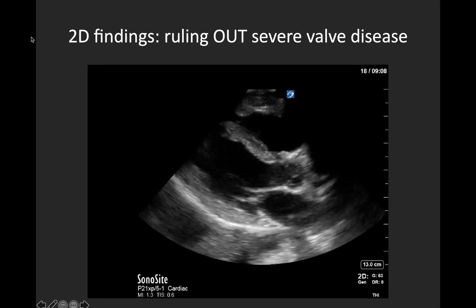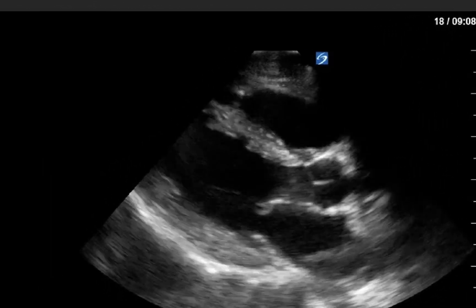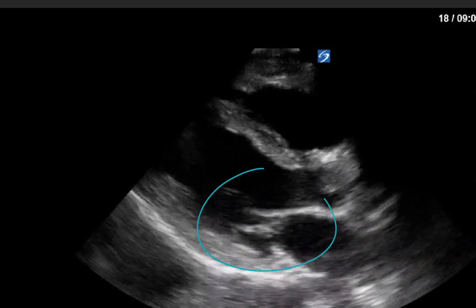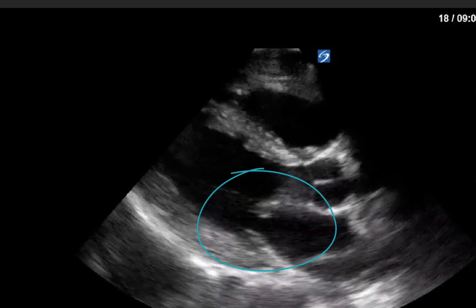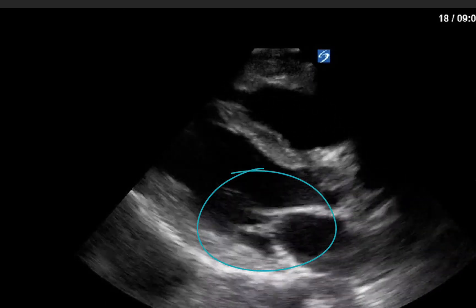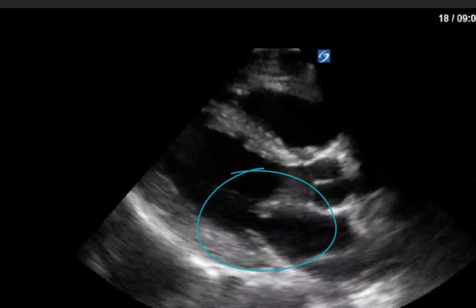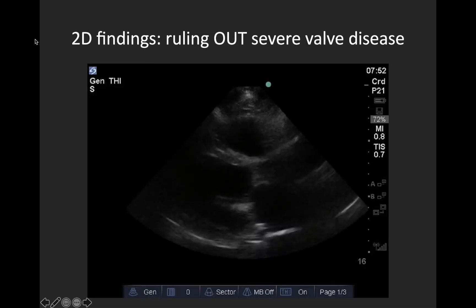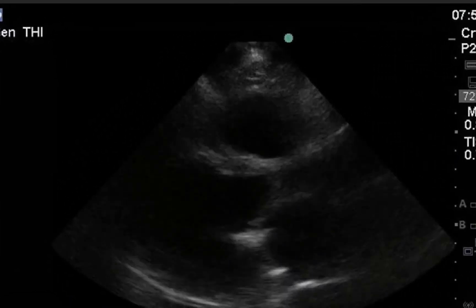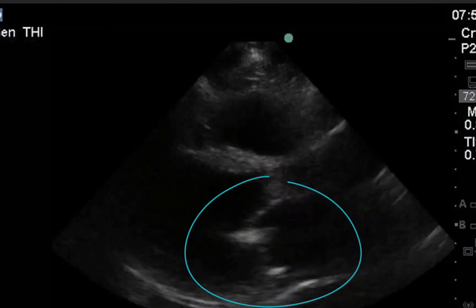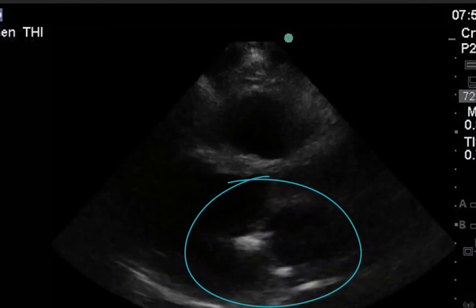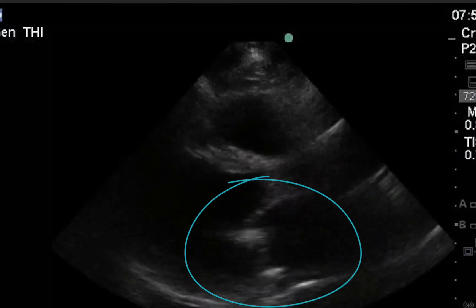Here again we're back to our normal parasternal long axis view, this time to focus your attention on the mitral valve — note thin, pliable leaflets that are opening nicely. In contrast, in this clip, although the gain is a bit dark, we see hyperechoic thickened mitral leaflets with really minimal opening, concerning for mitral stenosis.